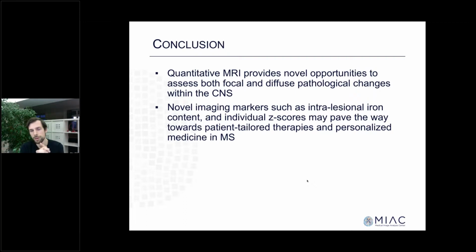And there's another scenario where you want to use quantitative imaging to see occult damage. And then of course you can use atlas-based segmentation approaches to define and automatically segment compartments of interest, and then you can also compare the T1, T2 or magnetic susceptibility within this compartment over time and between subjects. So the short answer is yes, there are a lot of solutions, I think, to calculate it automatically.